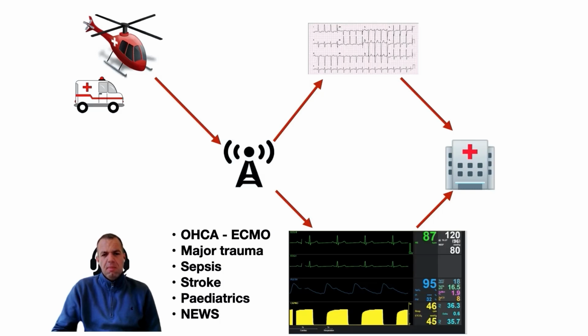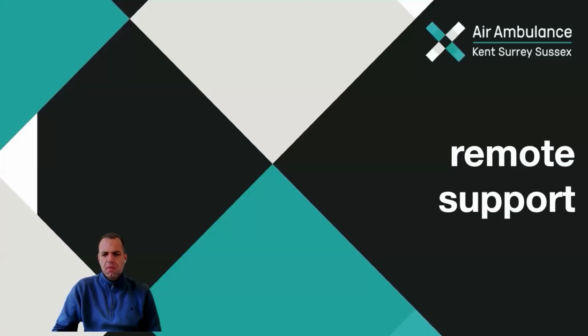So we're doing this on a regular basis now. When we have a critically unwell patient like Harry, we can literally flick a switch and the monitor goes on in the hospital and the hospital team can see exactly what we're seeing. So beaming the data to the hospital.